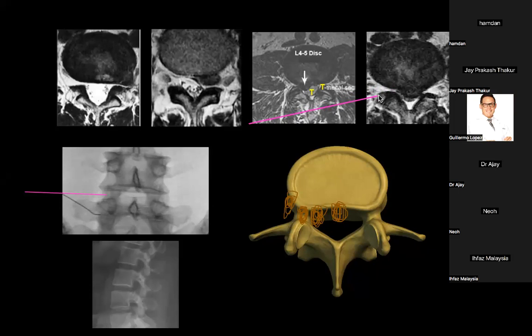Then with the SAP also, when you check in the lateral view, you may be hitting the superficial part, the middle part, or the lower part. If you see you are too superficial, on the upper part of the facet, you know that you have to change direction to hit the lower part. If you're already hitting the lower part, you know that now you just have to walk off the bone. So always keep checking the lateral view. Once you hit the SAP, check again which part of the SAP you are hitting: superficial, middle, or deeper, lower part. Is that clear? Good.